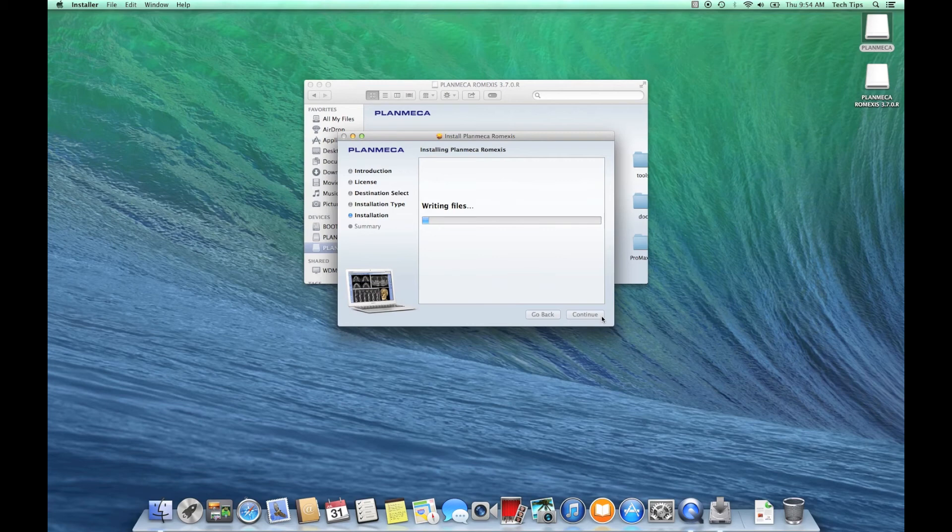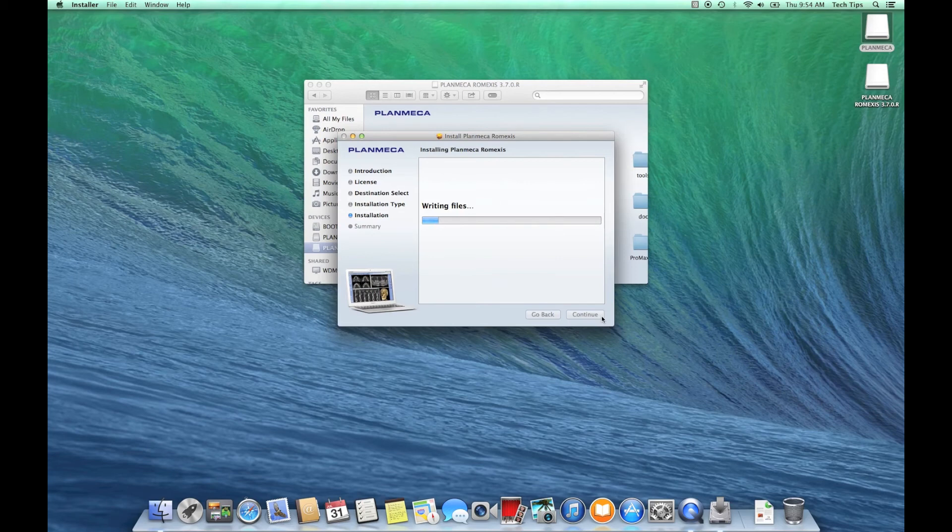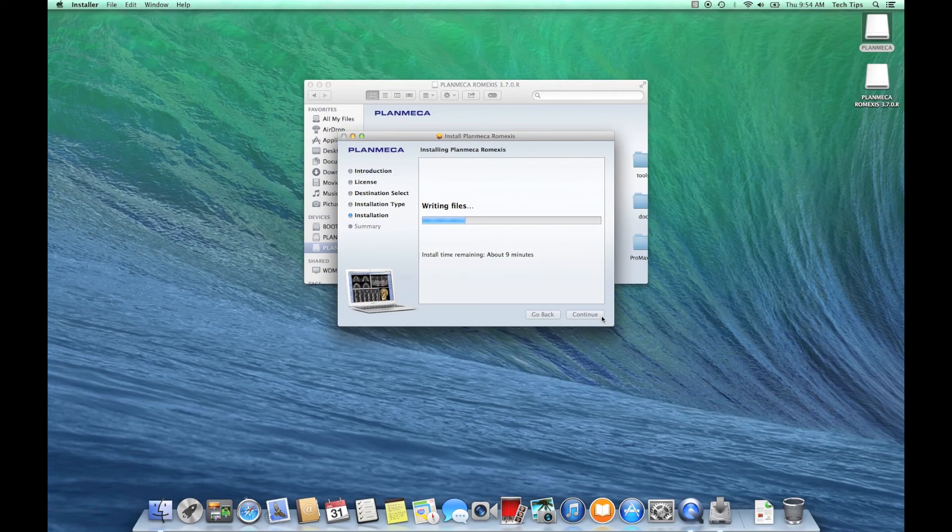Remember I am doing it from a thumb drive, so that's going to bring a little bit of extra speed to the process. Since I've selected all of the components, I'm bringing all Romexis's functionality to this computer.